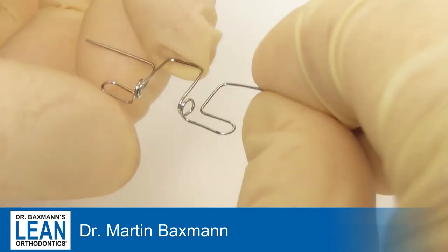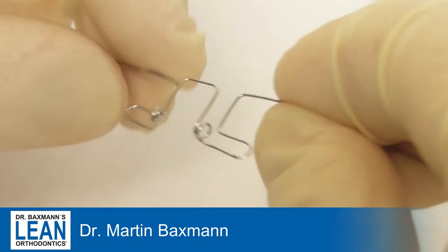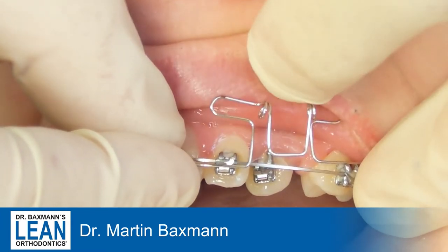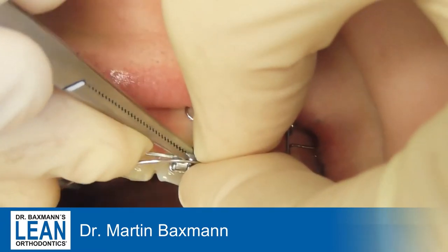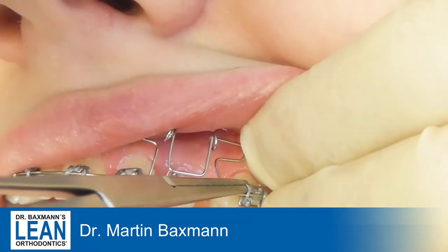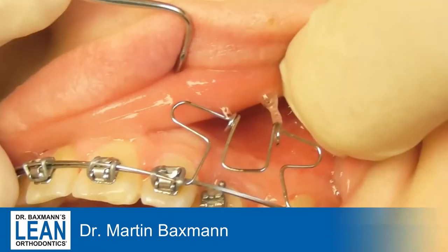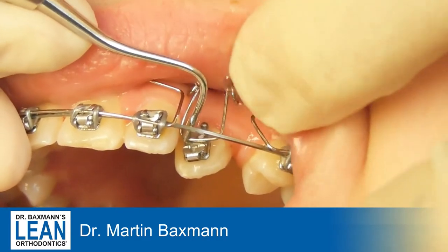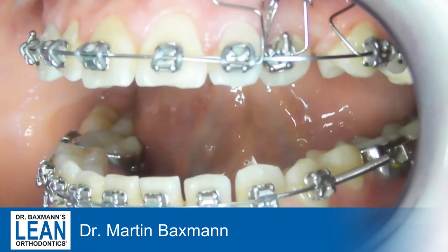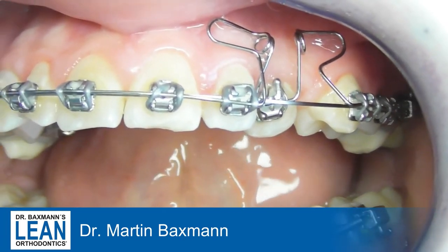Now we have to bring it into the patient's mouth. See the springy part of it — very nice. It occupies a little bit of space in the mouth, but that should be fine. We attach it at the mesial and distal parts like a piggyback wire with some extra elastics. The middle part of this spring goes in the slot of the canine, and you can see it will intrude the canine and bring it to the buccal side at the same time.